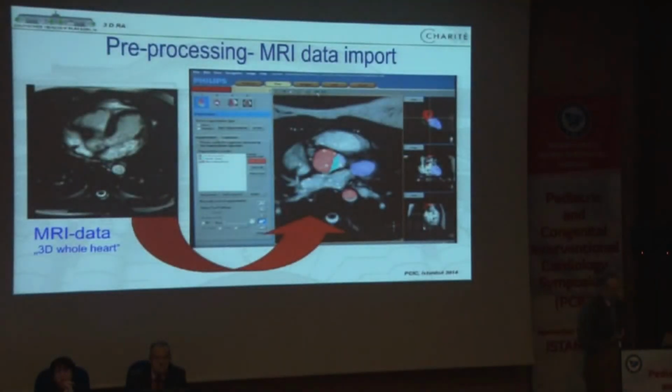So here you see how it works. The pre-processing is very important. These, for example, are MRI data from a 3D whole heart recording, and you have to implement these data into your angiography system.